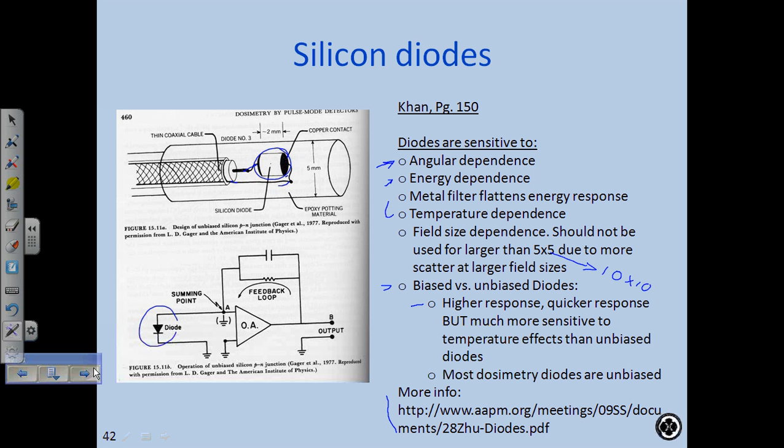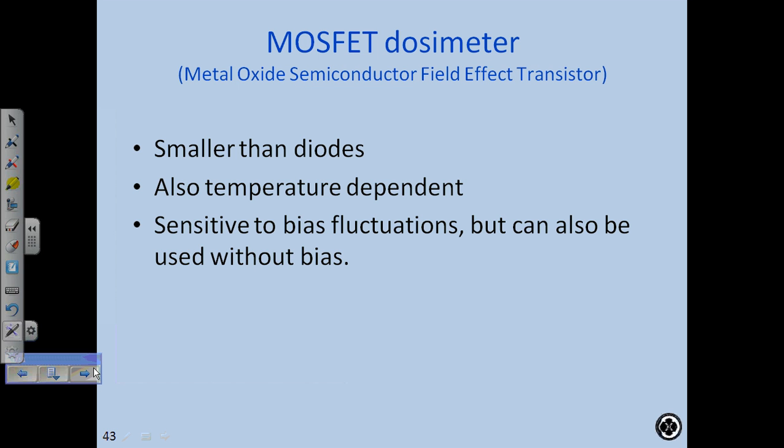Okay. So where do you use them? In vivo patient dosimetry and diodes. I use diodes a lot when I did my stereotactic beam data collection, because diodes are so tiny, I get really good resolution, so I can scan small fields at very high resolution. So patient dosimetry, scanning radiation fields, MapCheck devices. Okay, so that's where you see diodes.